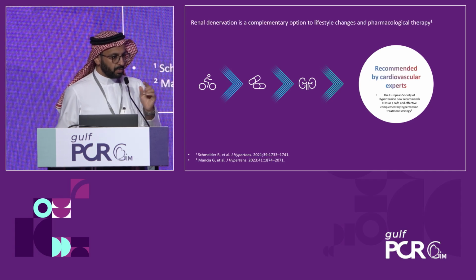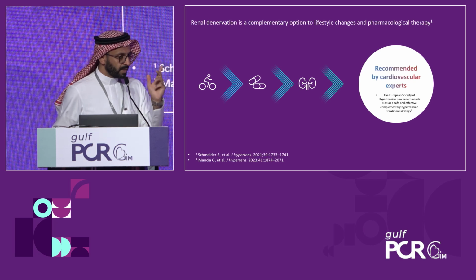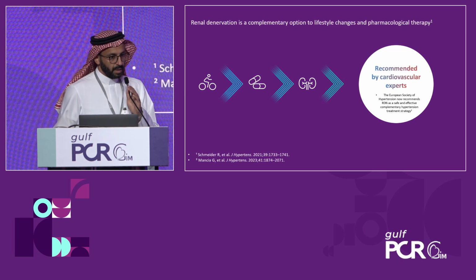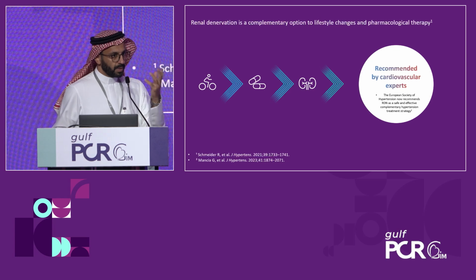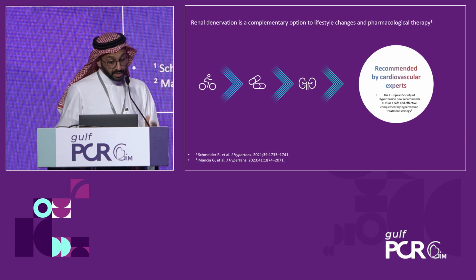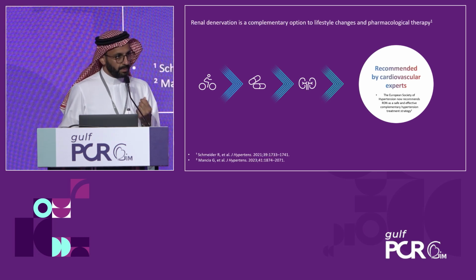And just to mention a subgroup of patients that are often forgotten, which I face a lot in one of my women's heart health clinics: women of reproductive age who don't want to be on antihypertensive drugs because they want to get pregnant. You know, the hassle of getting off medication. Renal denervation could be a viable option for treatment, reducing at least the pill load for them.